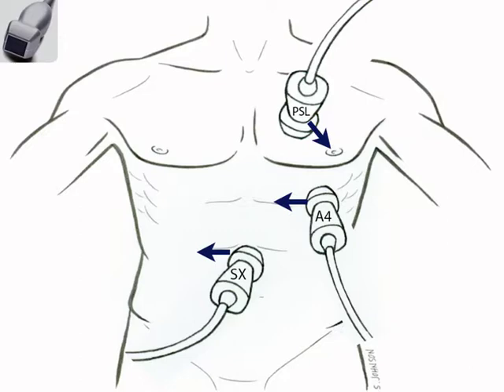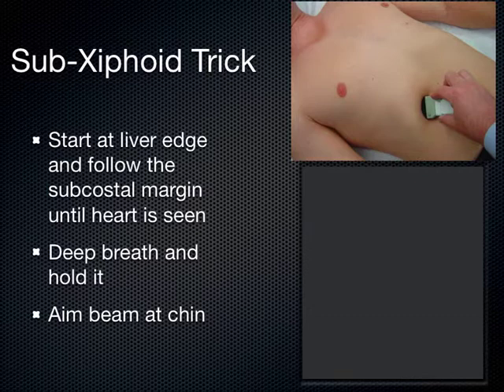And we'll start with that subxiphoid view. The interesting thing about the subxiphoid view, it's probably the one that people reach for first. Certainly the one that I reach for first when I've got a patient in shock. Just want to see if their heart is moving or not. In the setting of a code, is the heart moving? This is the first view I get.